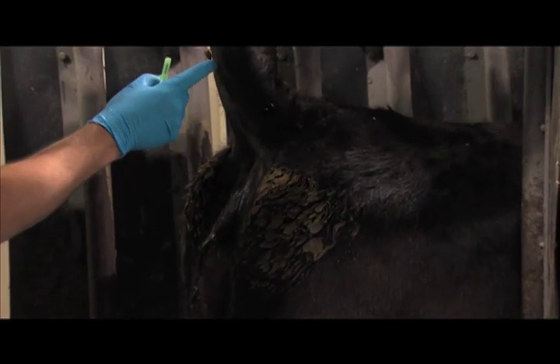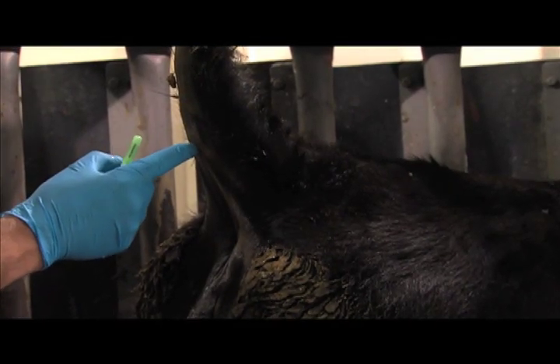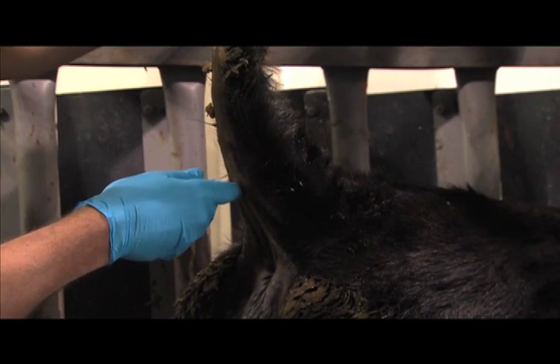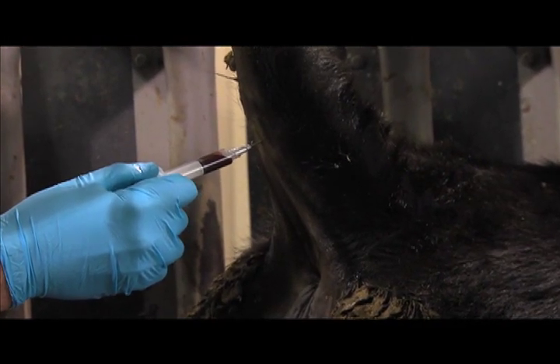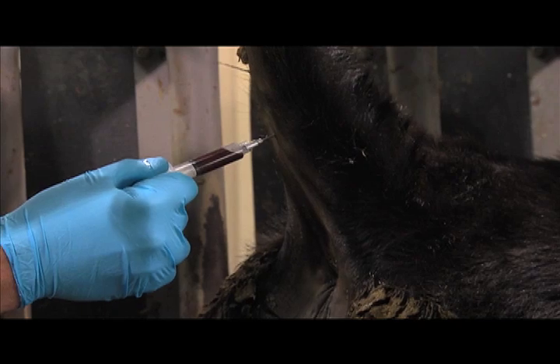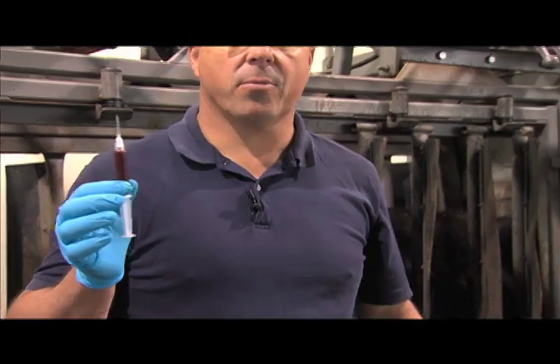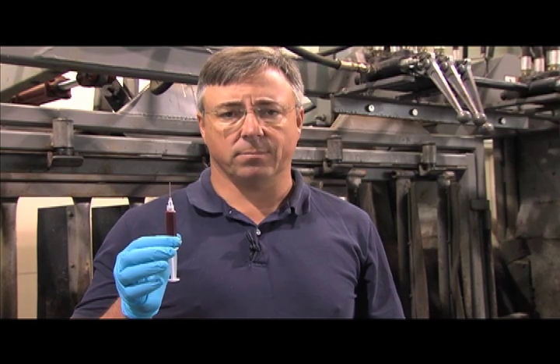If you look at the anatomy of the underside of the tail head, you will see a groove that runs right in the middle, and you can actually feel bone on both sides. Your goal with the tail sample is to go directly into that groove and perpendicular to the tail. About 3 milliliters is what's necessary to obtain a good sample for pregnancy determination.